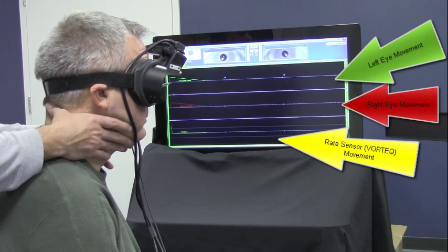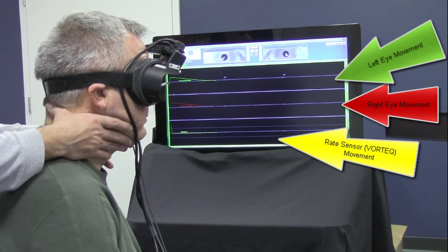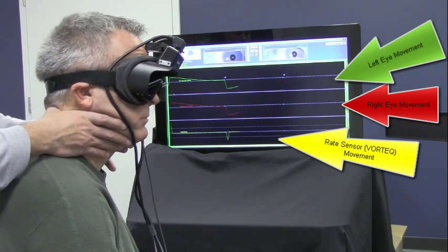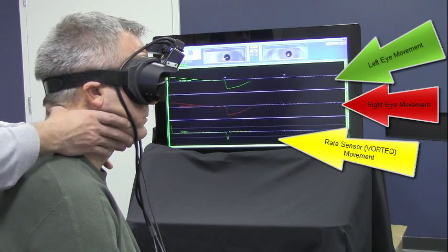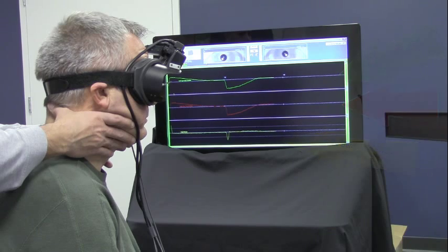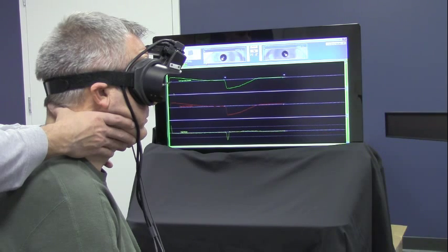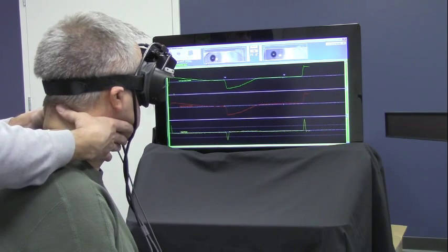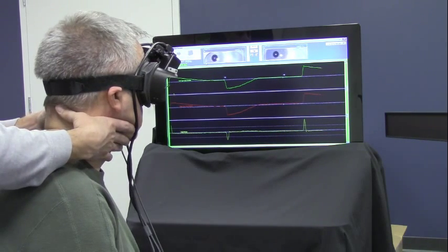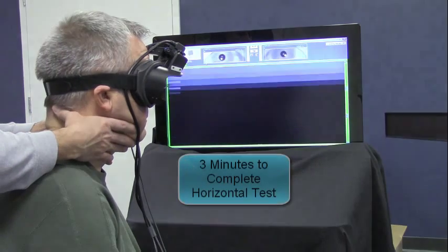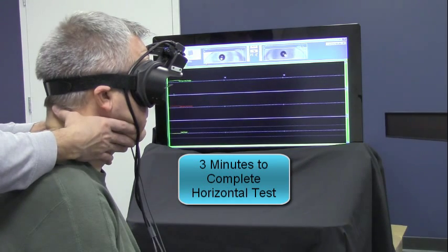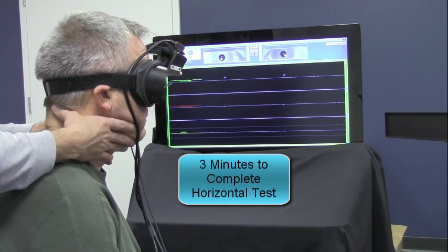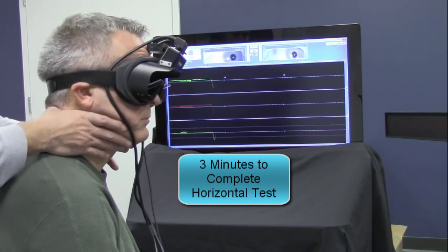Some practitioners like to bring the head to the center and then go out, and that is still possible. Just bring the head back to the center position very slowly and then you can go out. Some folks think this is easier on the patient's legs, so they like to do that.